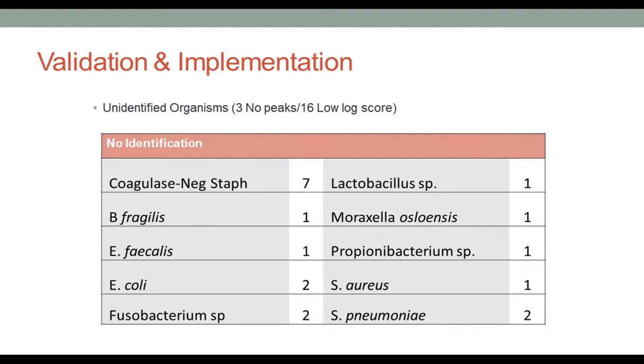Well, since we only use one media, that's actually not true. When we started doing this, we acquired some other hospitals, and they were using a different blood culture media, a different blood culture system. So when we got these new instruments, we had to do another validation study for the other type of media, and we really didn't see any difference between the different medias.